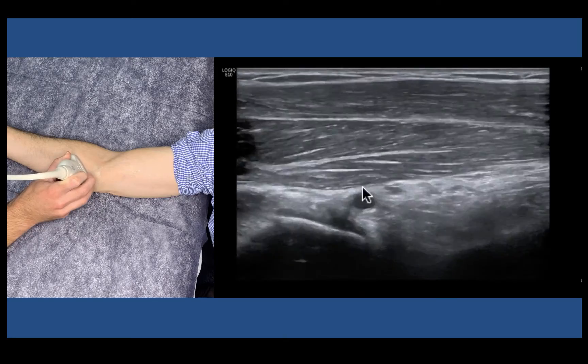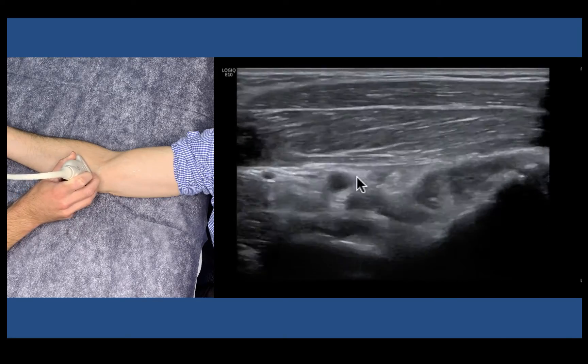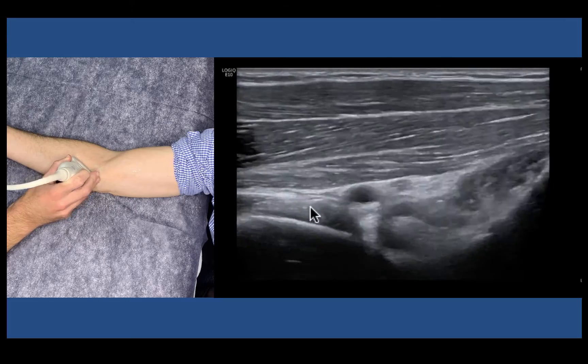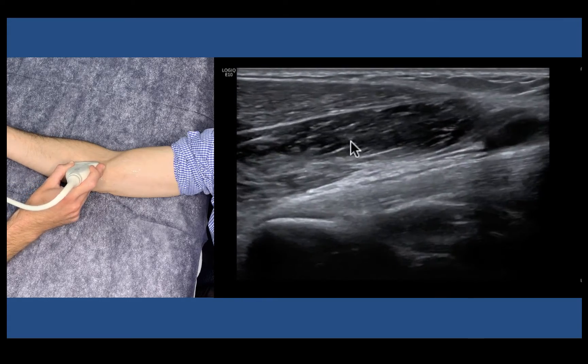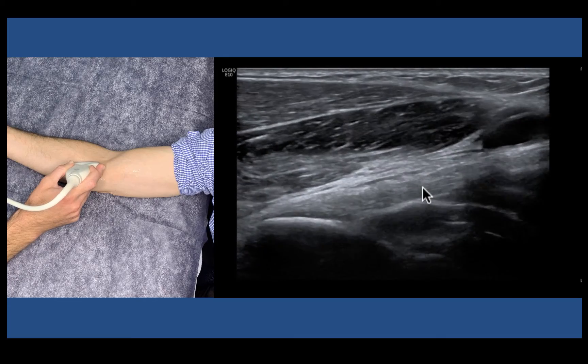We'll go back to short axis. Here's our neurovascular bundle, our median nerve, artery, and here is our tendon. Turn longitudinal again, shooting through pronator teres to see the tendon nicely.